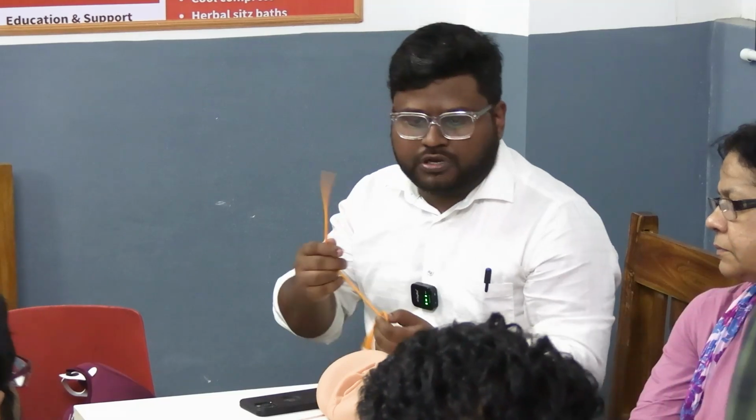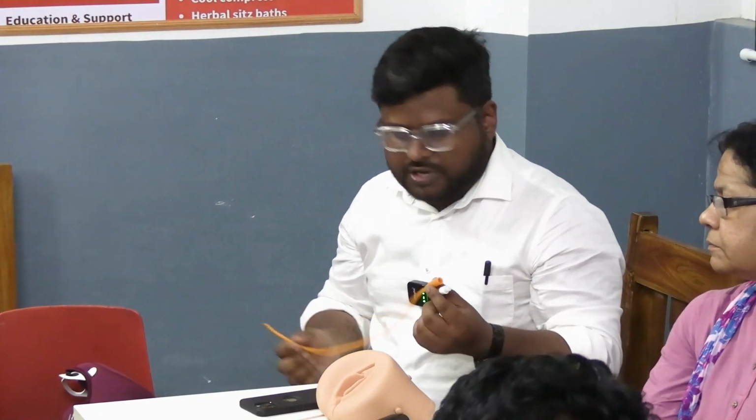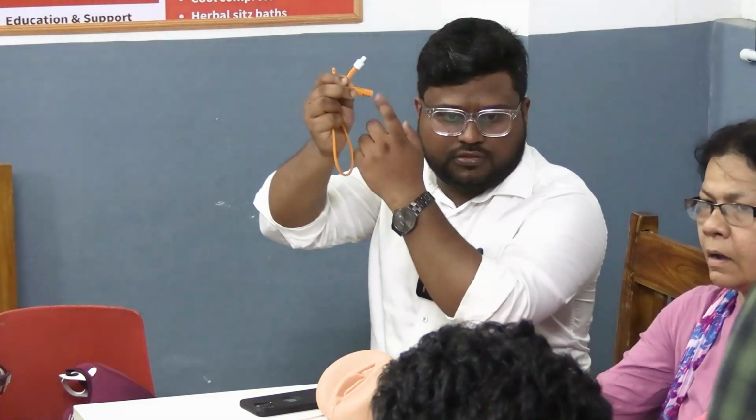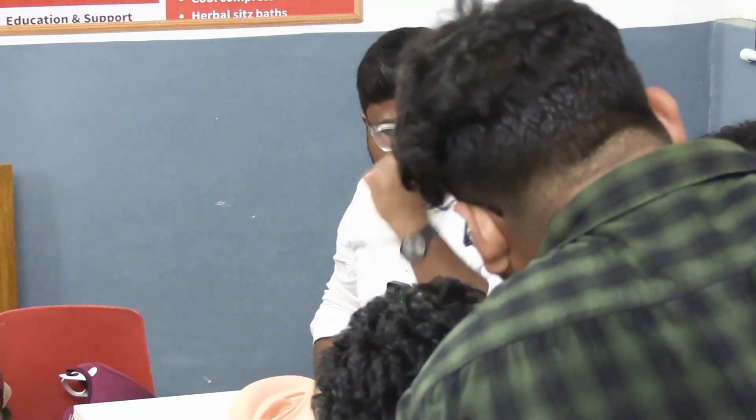Something called a Foley's catheterization. This instrument is a Foley's catheter. This is available in multiple sizes. The size is written over here. What is written over here? 12 French and something else is written here.